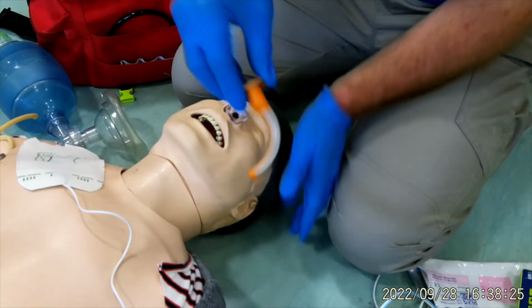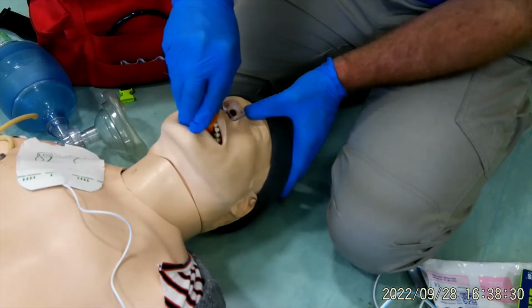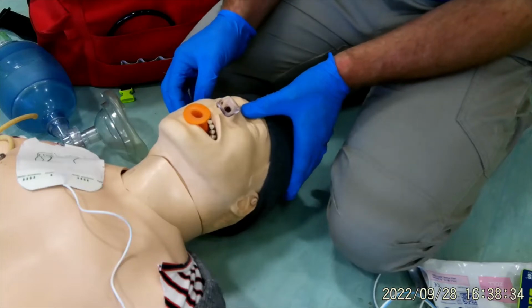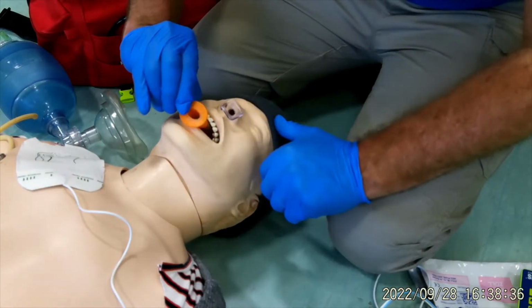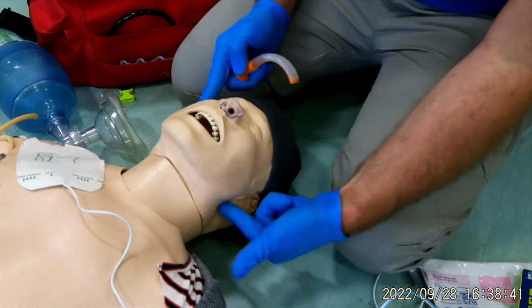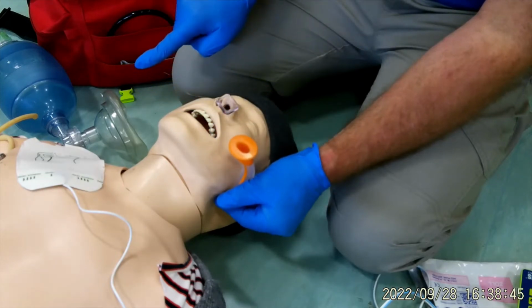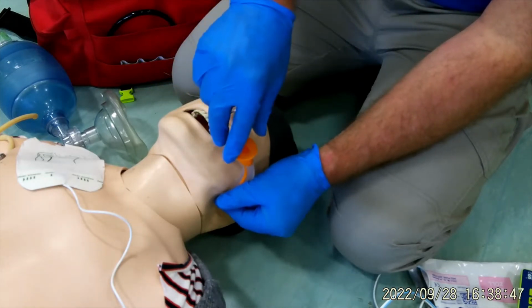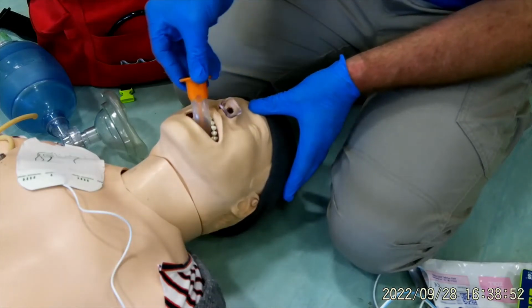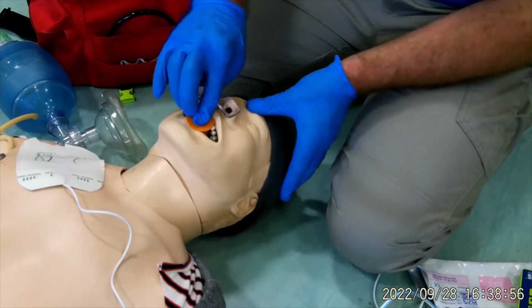We then invert, insert, rotate, locate. If they gag on it or we have to remove the oropharyngeal airway, it then comes out towards their toes. So I'll go through that again. So we've got the angle of the jaw, the oropharyngeal sits on there, the flange is level with the incisors. Once we've got the right size, we invert, insert, rotate, so it's like a corkscrew, we're going round and down at the same time, and then locate.